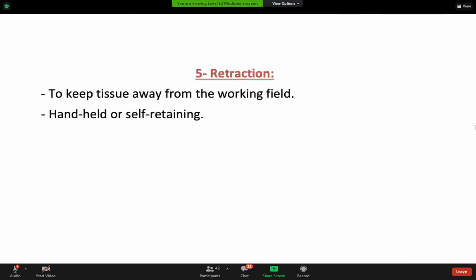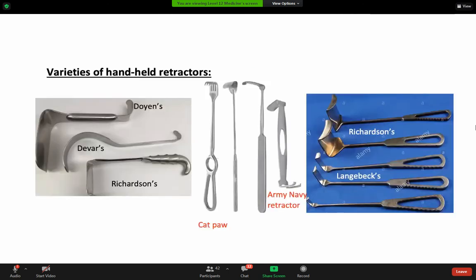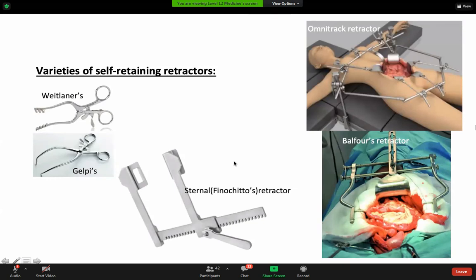Retraction instruments can be handheld or self-retaining. Handheld retractors include many types, such as the Deaver retractor. We also have self-retaining retractors that can be used to retract tissue without an assistant holding them.